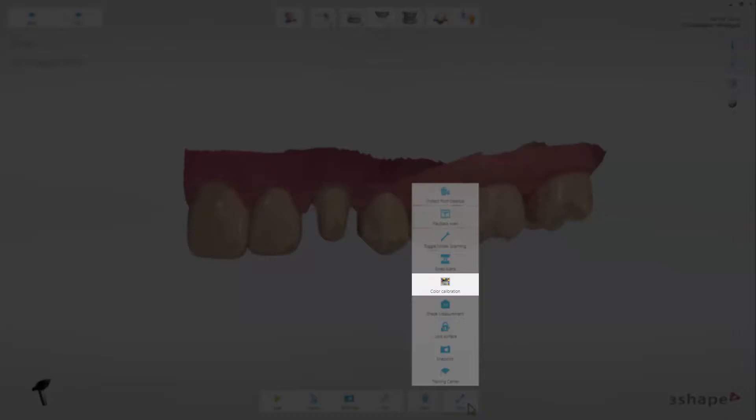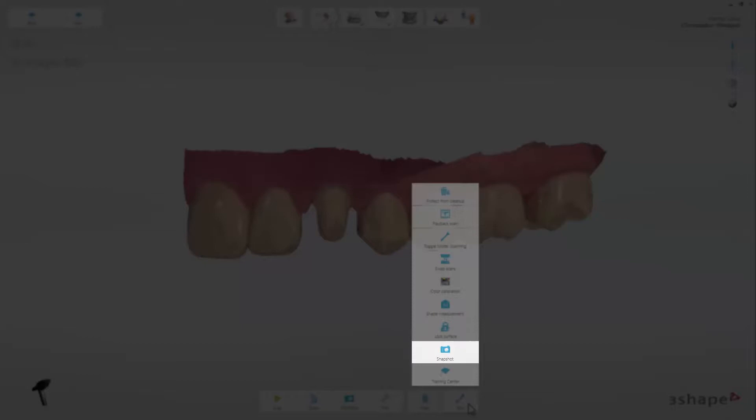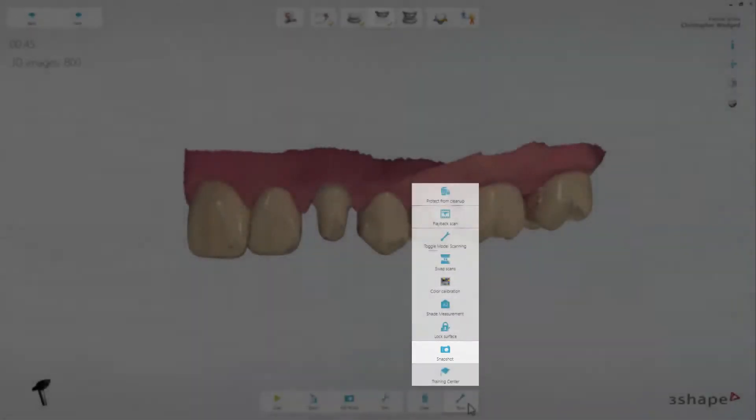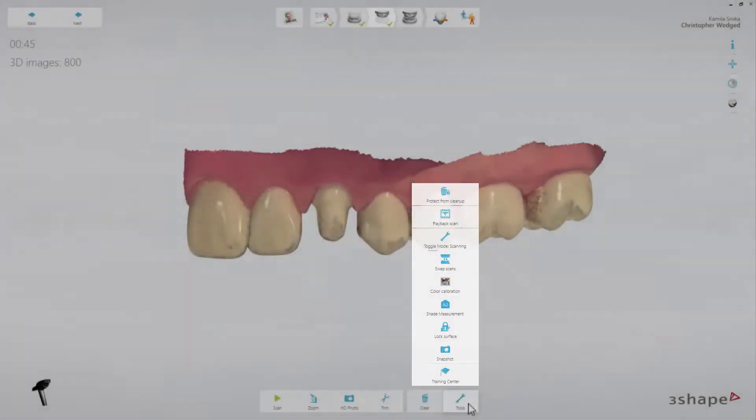Color Calibration starts the color calibration guide. Shade Measurement opens the shade toolbox and allows you to use the shade measurement feature on the scan page. Snapshot adds a screenshot to the order.